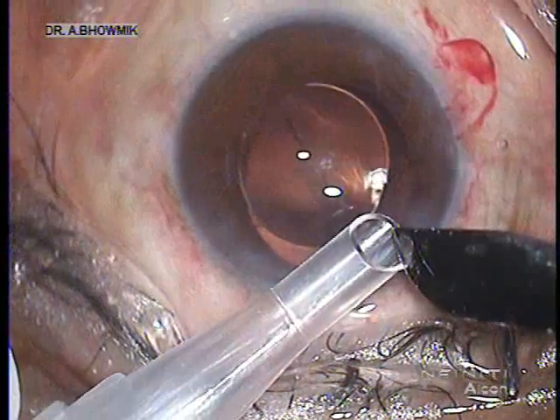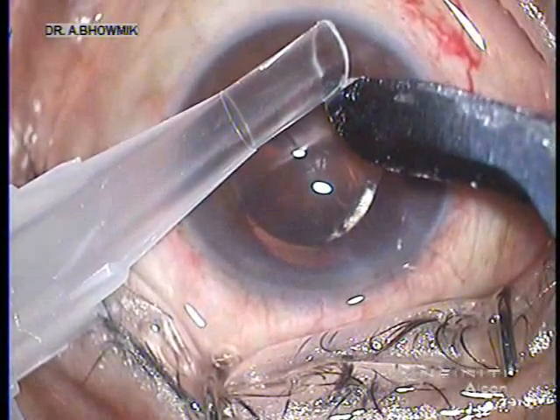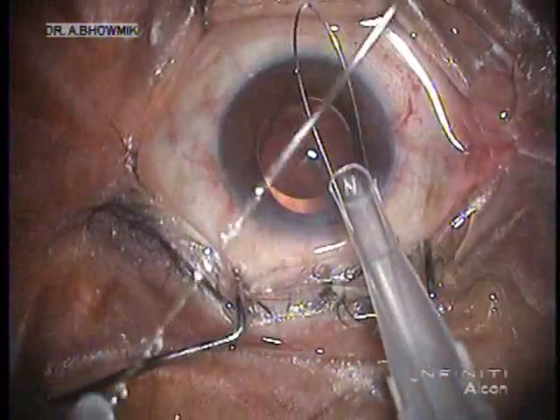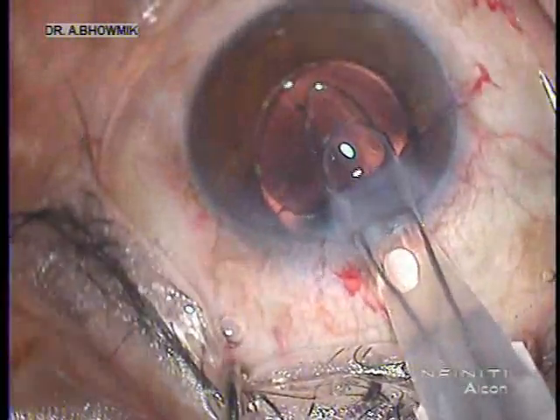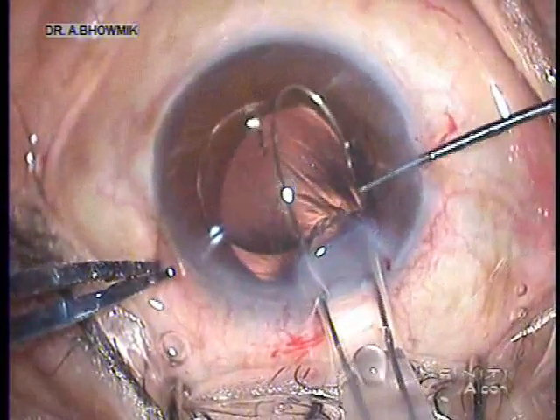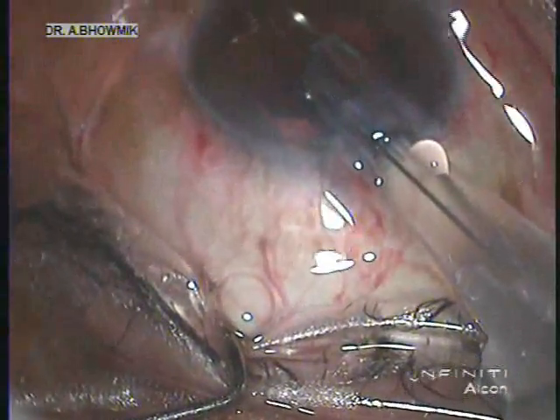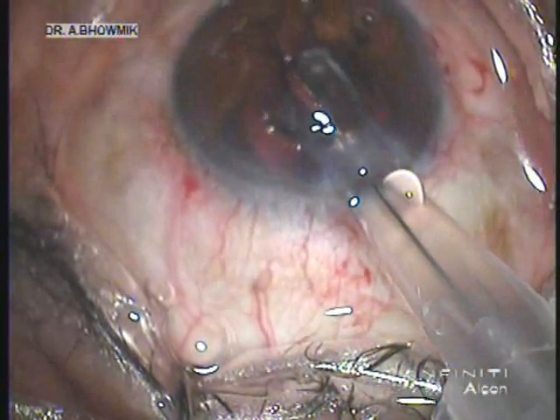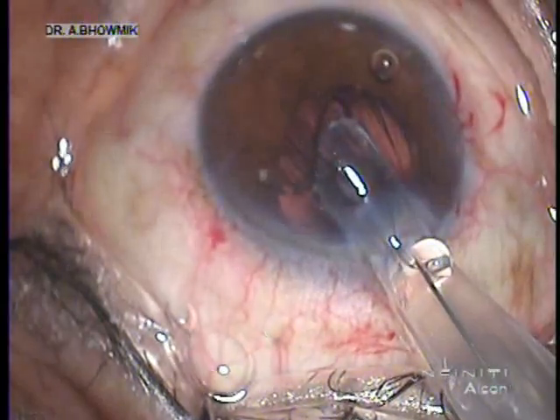Encouraged by our wet lab experience, the same technique was followed for a single-piece hydrophilic lens that was damaged during implantation. A Monarch A cartridge cut on either side and a snare was introduced through it. This modified cartridge was then introduced through the same corneal tunnel under viscoelastic cover. The snare loop was opened and the IOL was engaged into the loop using a Sinski hook. On gentle pulling of the snare, the lens was explanted through the cartridge.